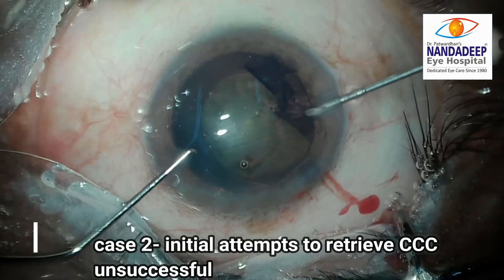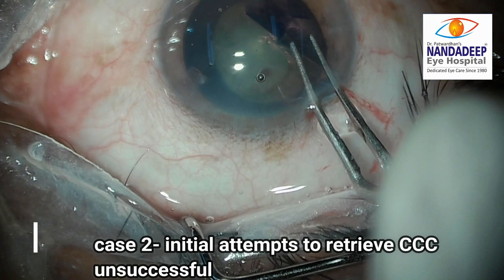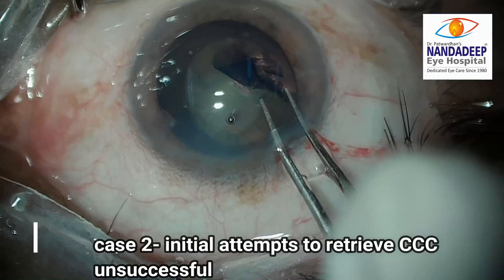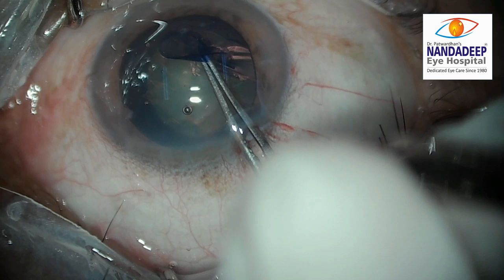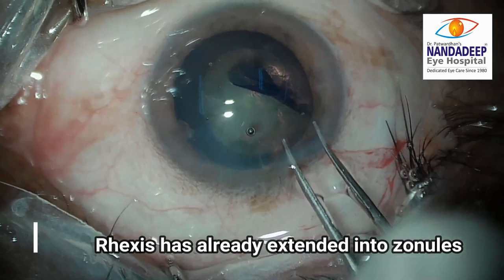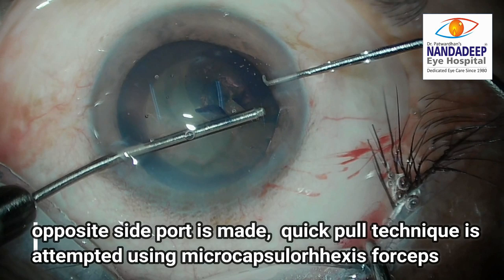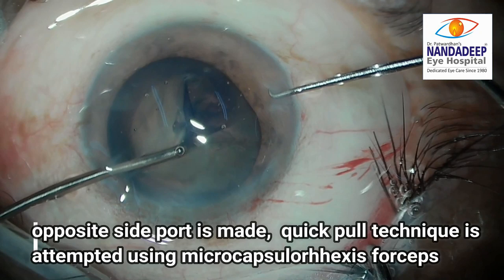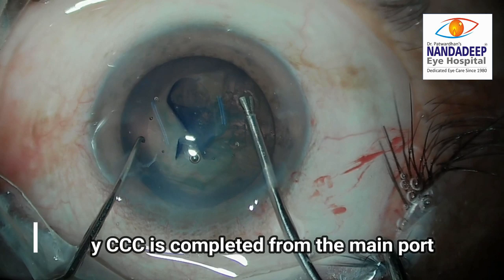In the second case, after the rhexis extends to the zonules, initial attempts to retrieve it are unsuccessful. Again the microcapsulorhexis forceps is introduced from the opposite side and a quick pull is given to the anterior flap directed to the center of the pupil. This helps in retrieving the capsule. The rhexis is then completed from the main port.